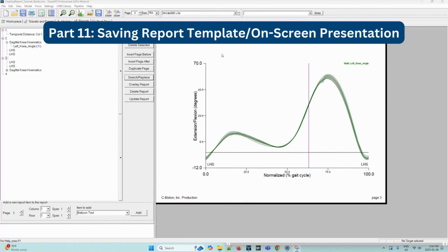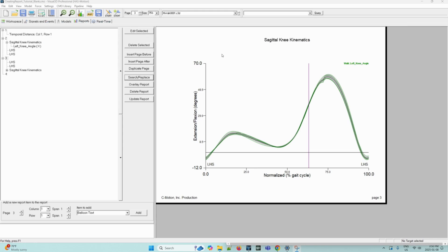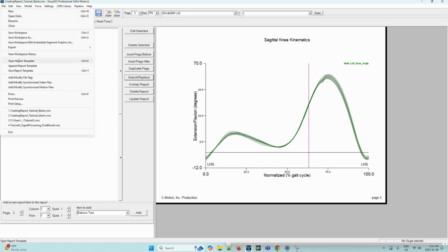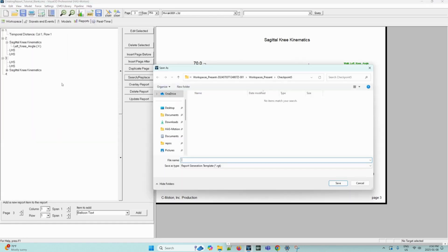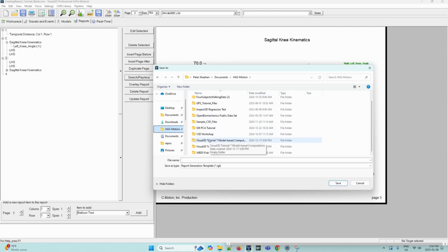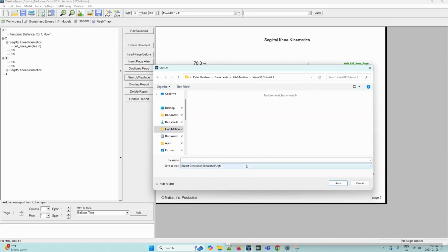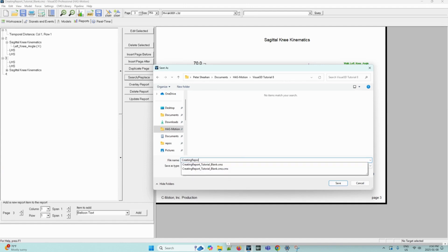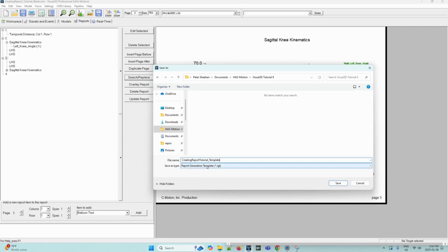Next, we can move on to saving the report template and having an on-screen report presentation. We can save the report template so that they can be applied to other CMZ files. To save a report template, you can navigate to the file menu dropdown and then select save report template. Now navigate to your required folder and then we can save this specific template as creating report tutorial_template. And this will be saved as an RGT file. Now we can hit save.